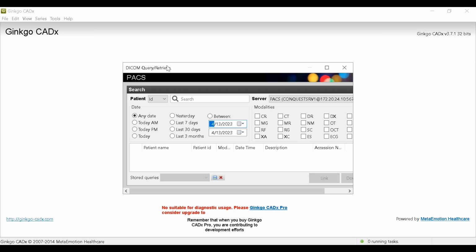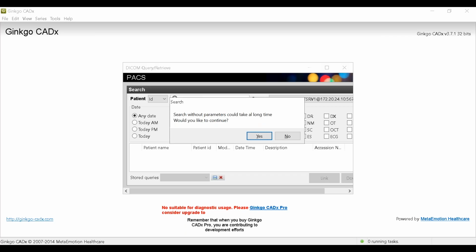But I love the fact that this thing says query retrieve. We're going to do two things. The first one is a query. What do you got in your database? It's going to give us some information, then it's going to stop that communication. Let's do that. I'm just going to say, hey, show me everything. I'm going to leave everything blank. I'm not going to tell it what to filter for. I'm going to hit enter.